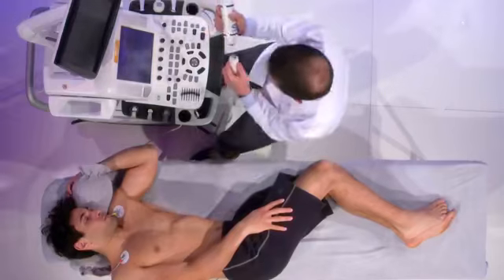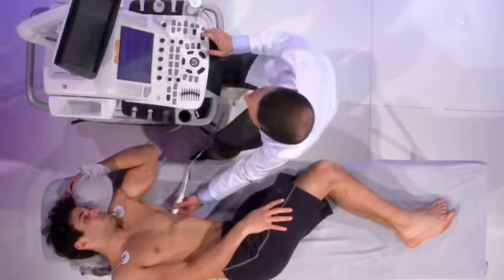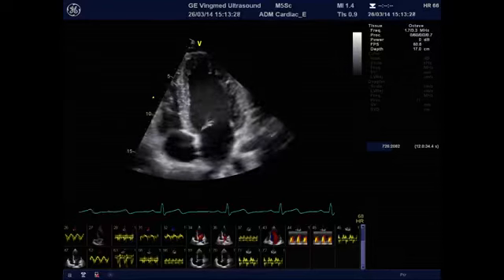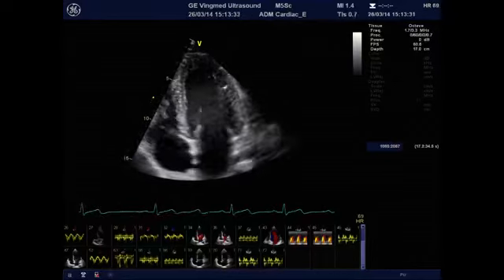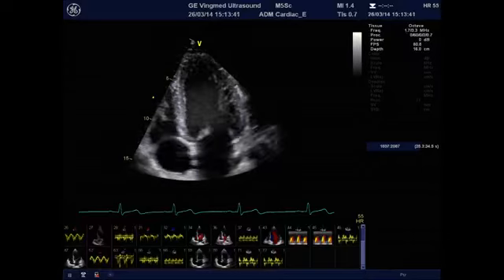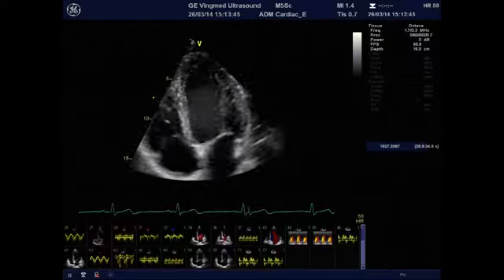Conversely, in a patient with a very sick ventricle, dilated with poor function, it will take a long time for the wave to reach the apex, because it will not travel directly, it will rather go in circles towards the left ventricular apex. So, velocity propagation was shown to relate with the time constant tau of isovolumic relaxation, and this is the background of using it. How do we practically do it?